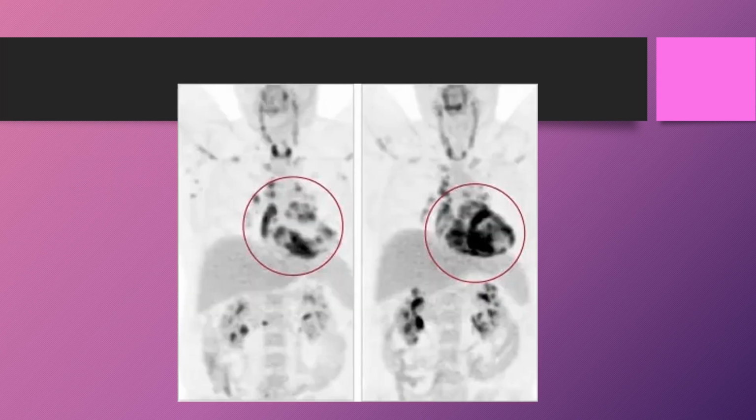In this image, you see coronal views of a patient with sarcoidosis. Patient was scanned for diagnostic purposes. In the first image, sarcoidosis can be seen, particularly in the left atria and along that inferior lateral wall. And then in the second image, the patient is reevaluated, and you see much more advanced disease seen throughout the heart. And so you can even see it there in between the atria and the ventricle, across the anterior and inferior walls, and in the atria.